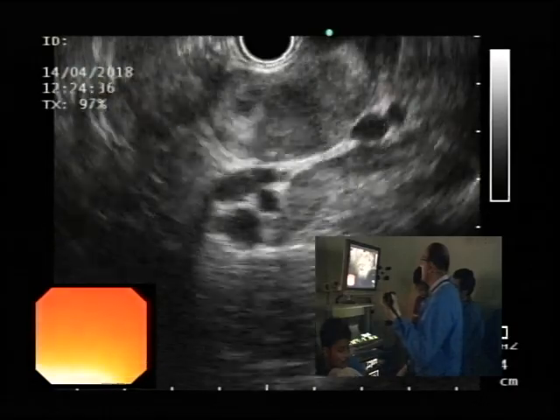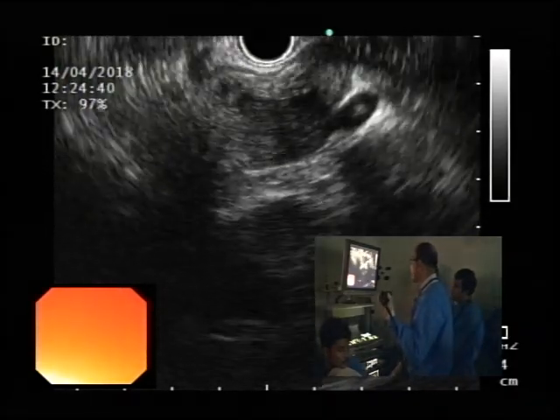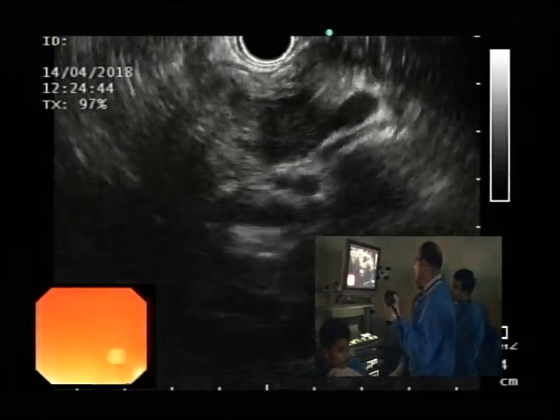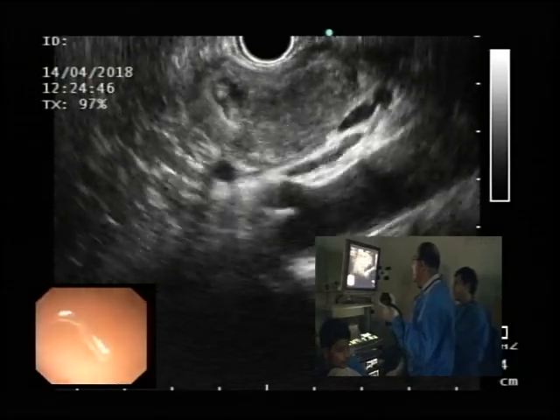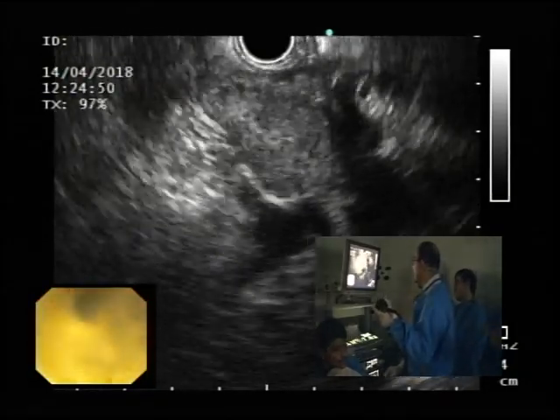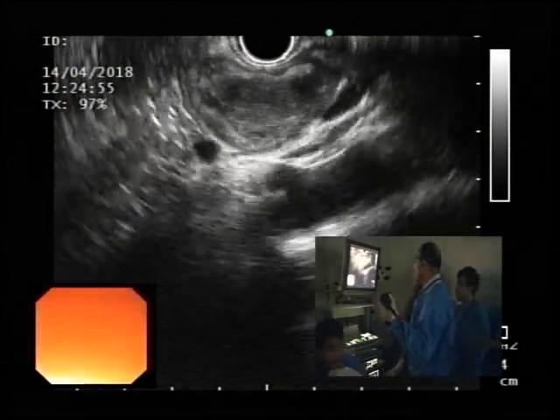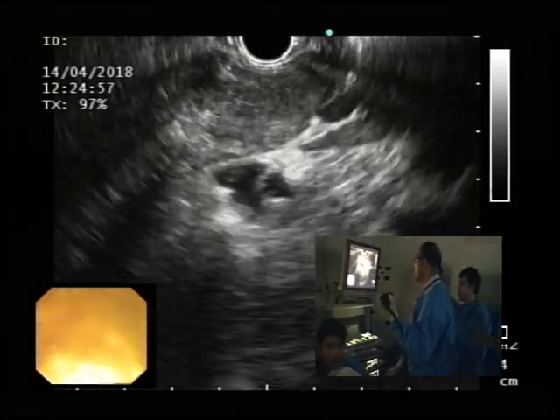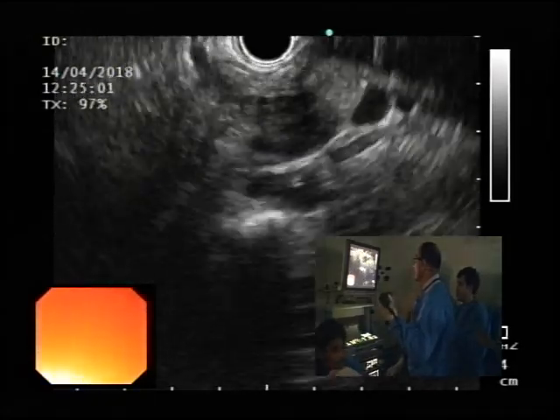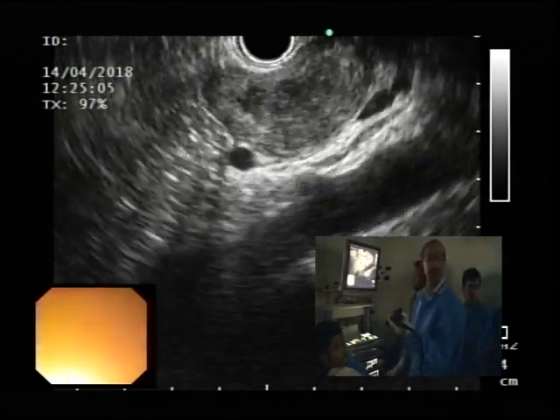Now this is where this exam is challenging, because this is a grossly abnormal pancreas. Upar se ye ki we don't have the best image quality, but here we are, I'm pretty confident looking at what is the pancreas. Overall it's okay, but ye ki obviously compared to the other machine it's not ideal. And that's the problem. It's the ME1, I think. Kya kare?